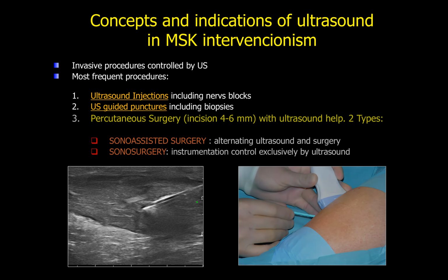Lately, ultrasound has helped us also in surgery, especially in percutaneous surgery with little incisions, alternating ultrasound and surgery, known as sono-assisted surgery, and also in the last years by instrumentation control that is exclusively controlled by ultrasound, sonosurgery. The advantages of sonointerventionism are well known.